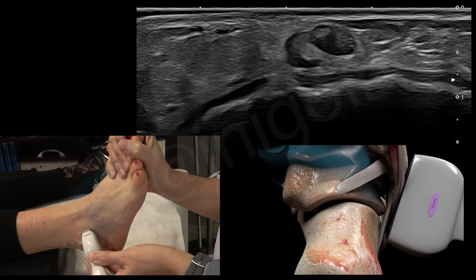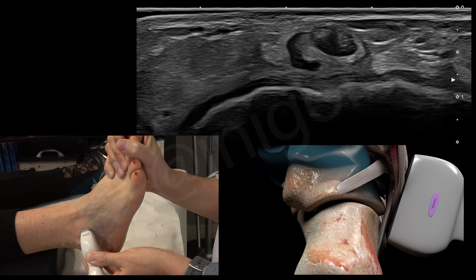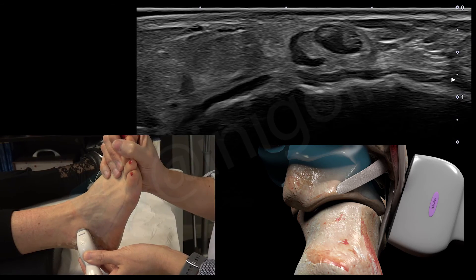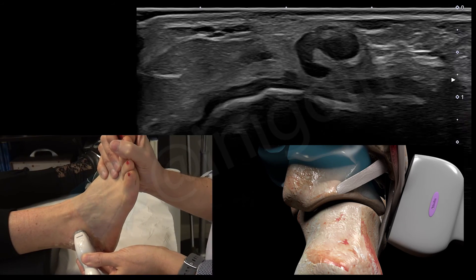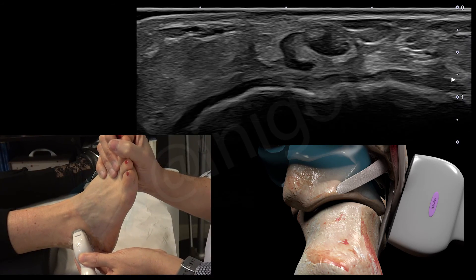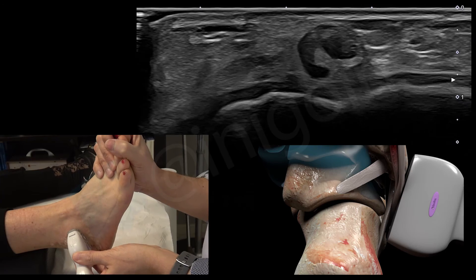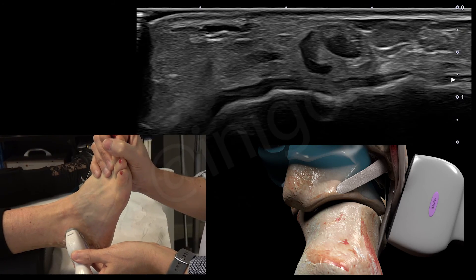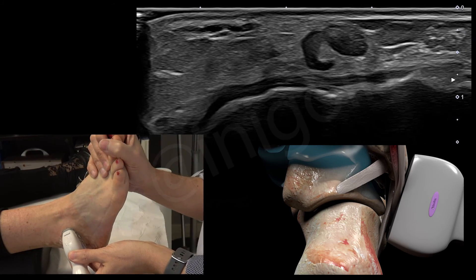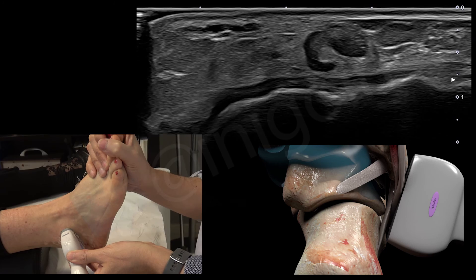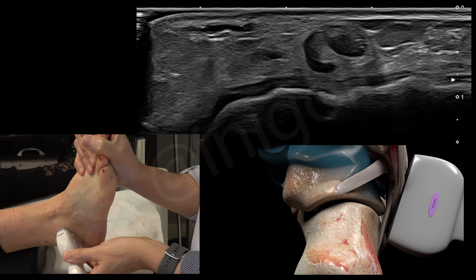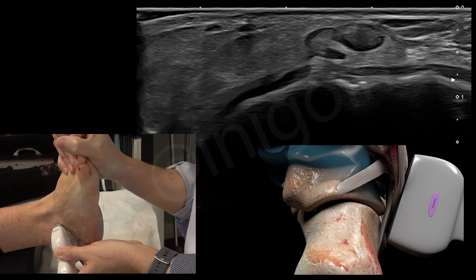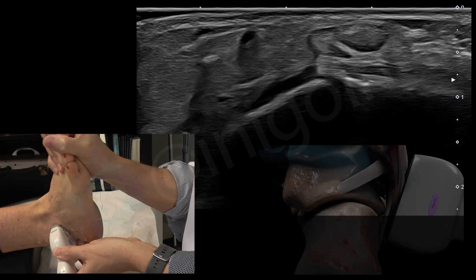This is not the best example of this ligament, but patients are real and sometimes this is normal to find. You can see here the fibrillar pattern of this ligament and the absence of movement with dorsiflexion.